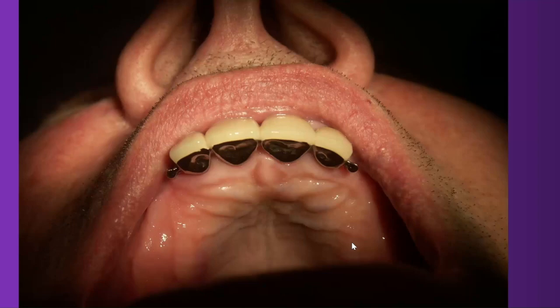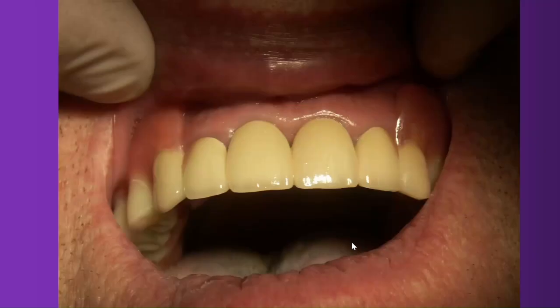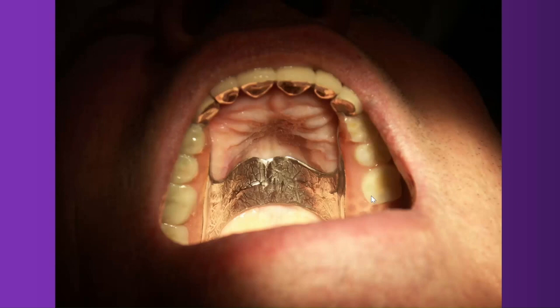That's the aspect of the denture. Nice that the first teeth are ceramic. You see here the margins of the saddle, the resin saddle. And that's the aspect of the whole denture. And this lasted 8 or 9 years. After that, it looked like that, upper and lower.